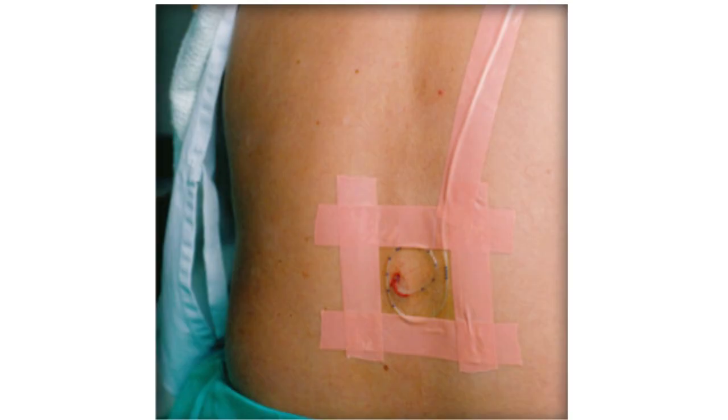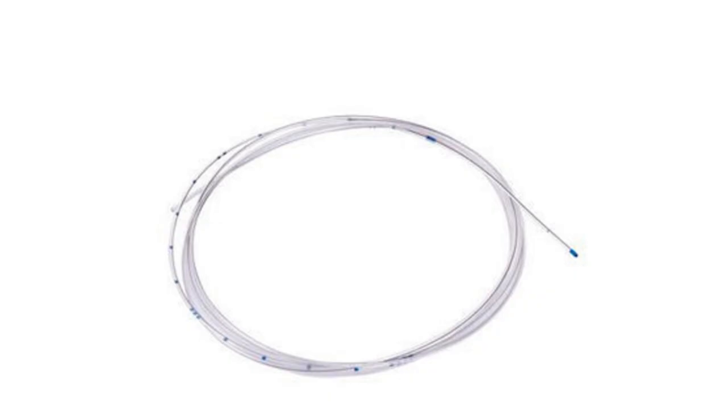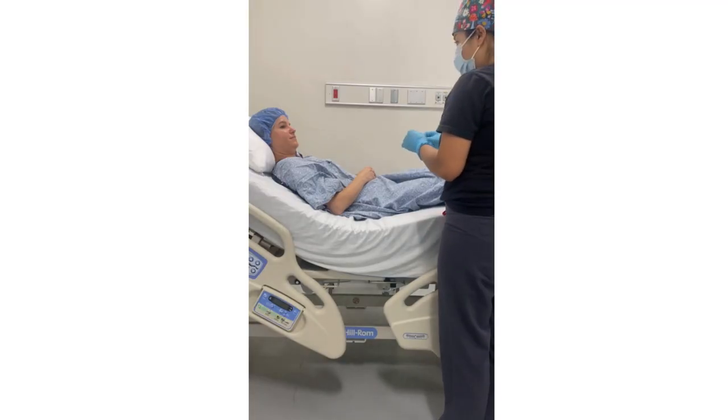After delivery, when the epidural is no longer needed, explain the procedure to the patient and have them sit up with their back slightly curved towards you. Gently remove the dressing, then apply steady, gentle traction to withdraw the catheter. Never pull forcefully, as this can cause the catheter to break. Once removed, visually confirm that the blue marked tip is intact. Finally, have the patient lie back comfortably and document your findings.